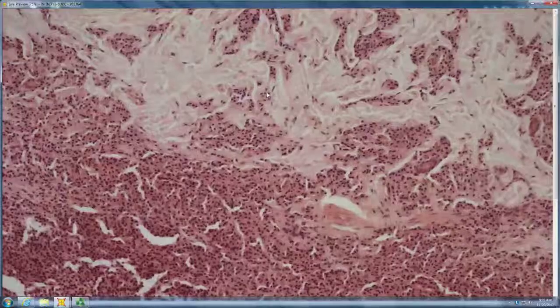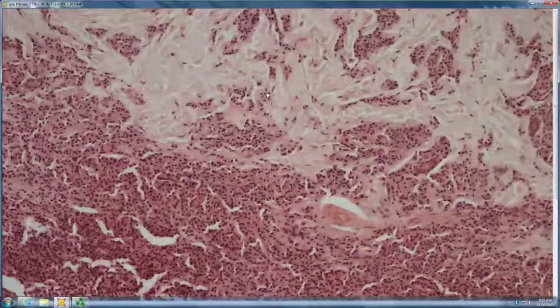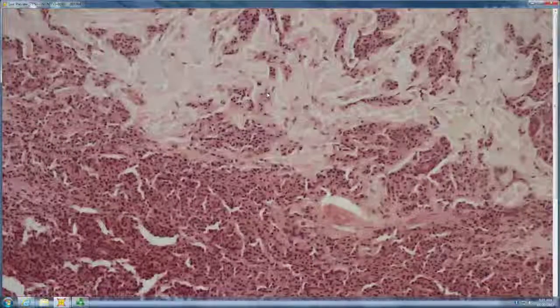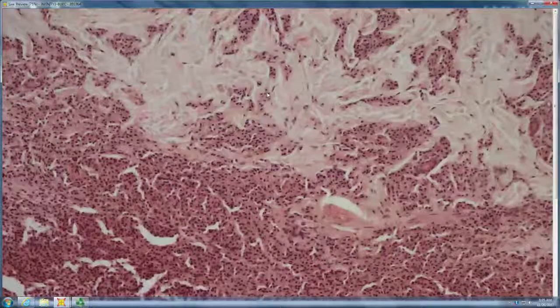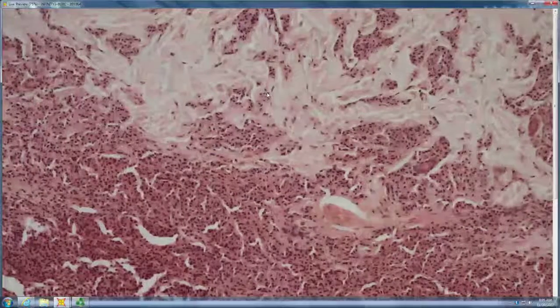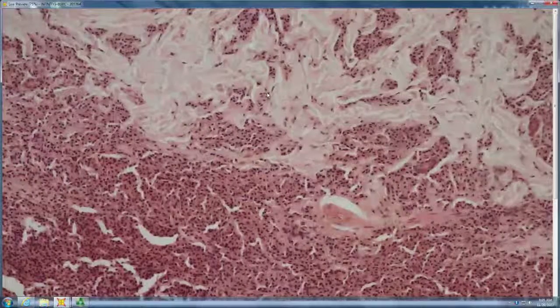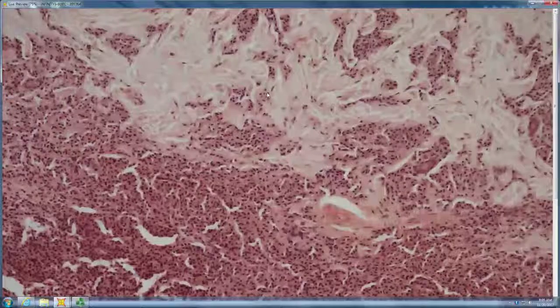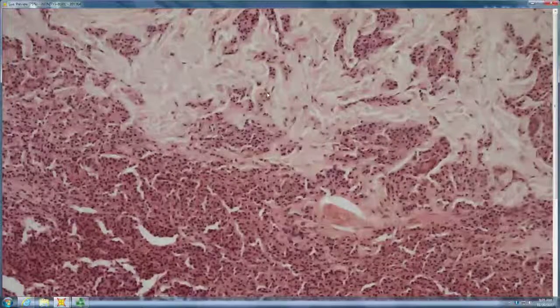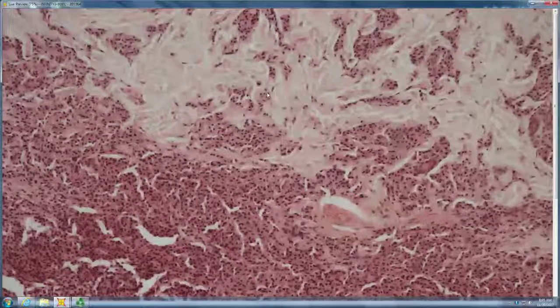But the so-called fried egg appearance, and when they tend to be in sheets like that, the nuclei are very evenly spaced. As opposed to an inflammatory infiltrate, where the nuclei vary in their spacing, mast cells, because the cytoplasm all tends to be about the same size, give you a polka dot pattern where they're all evenly spaced apart. And that's typical at scan for a mastocytoma.